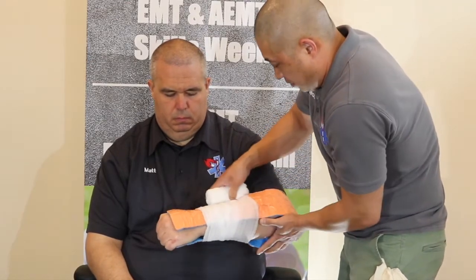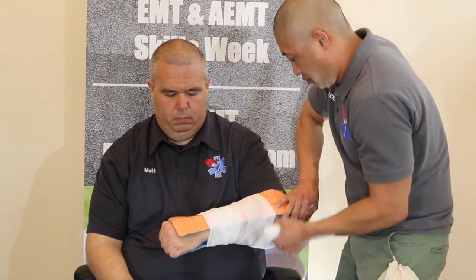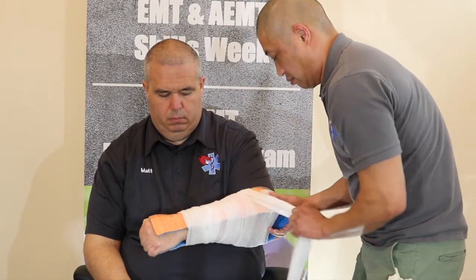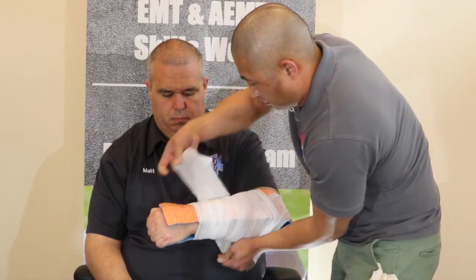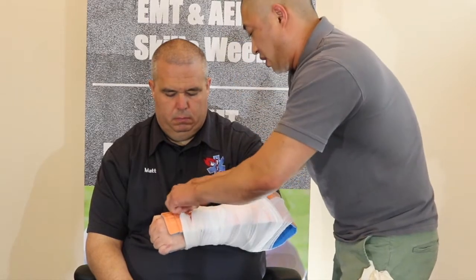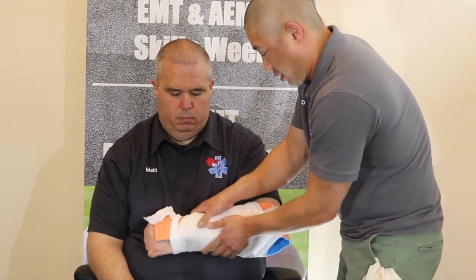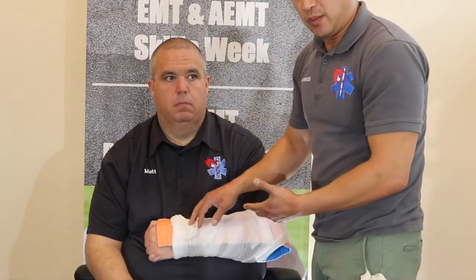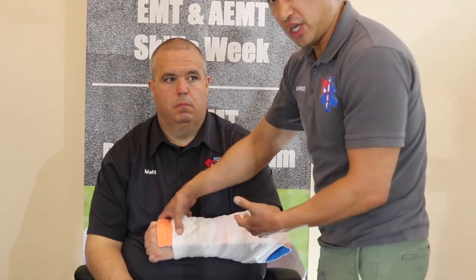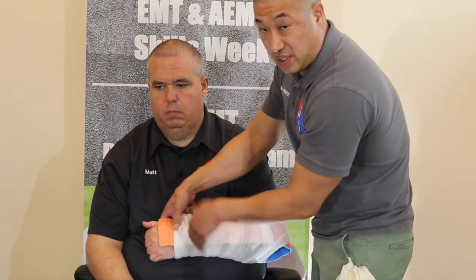We're just going to secure the splint to his arm, wrapping up around the elbow and locking that in place, coming down here to secure the rest. You can take the other end of your Curlix roll or just tuck it under and tie it off to make sure it's nice and secure. After we're done, we're going to immediately check PMS again. Sometimes it's harder with the splint on to check a radial pulse, so another way to check perfusion is capillary refill.